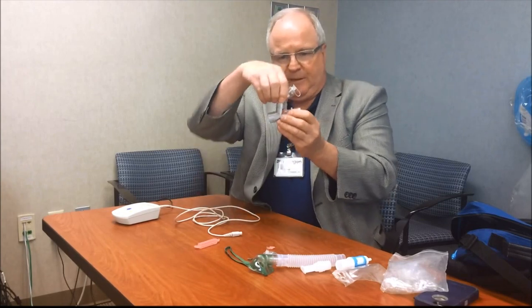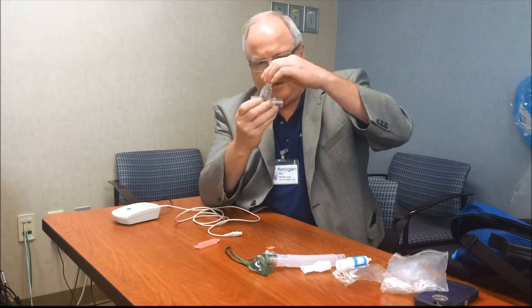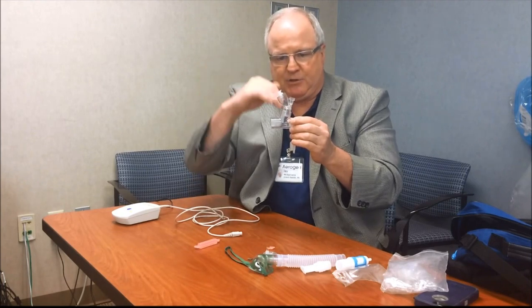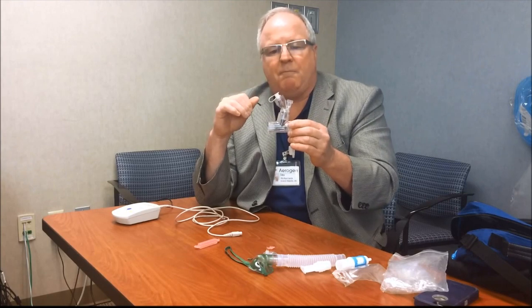So if I am going to set this in like this, you can see that my angle towards the vibrating mesh is less than if I was to rotate it this way. Now I have a nice steep angle down. So when I drop the medication in, it's got a steeper slope to go into the vibrating mesh. So we recommend always to have the steepest slope possible.